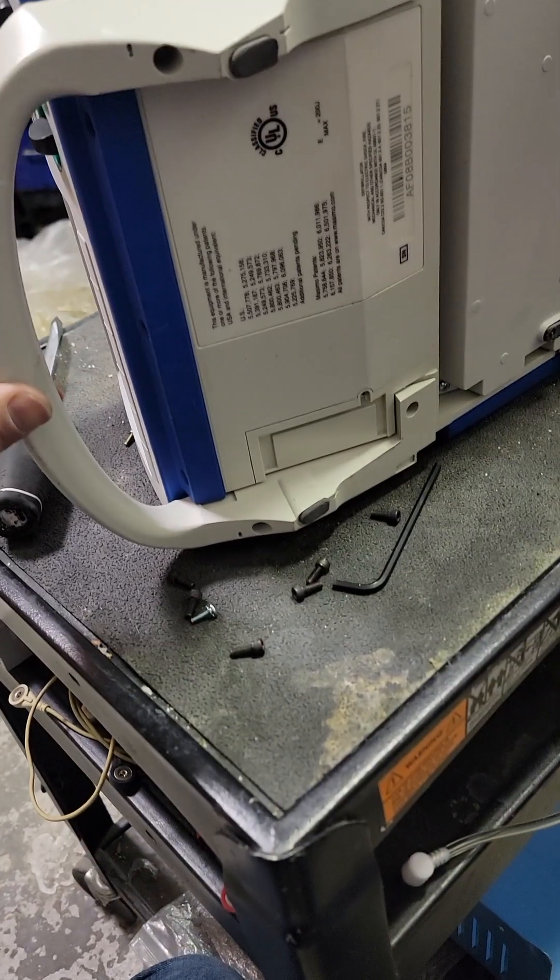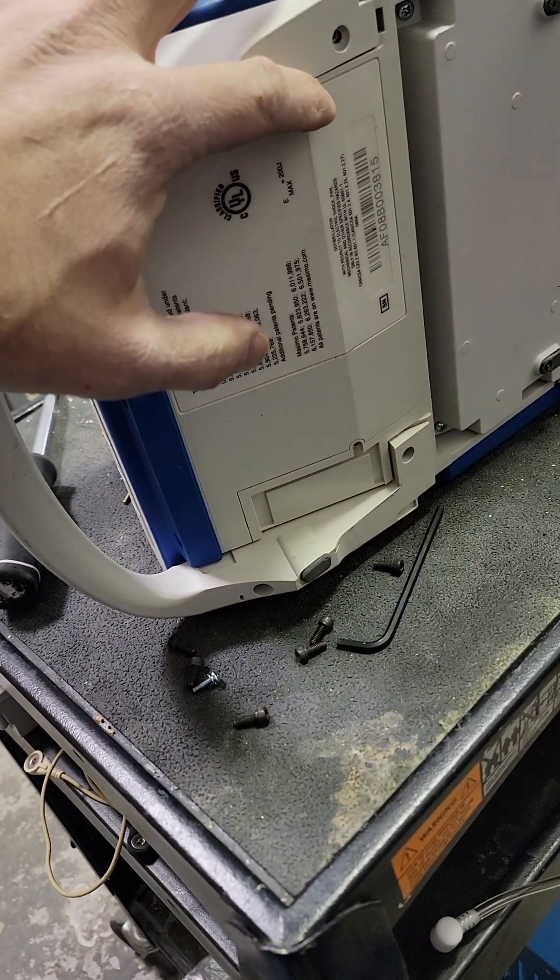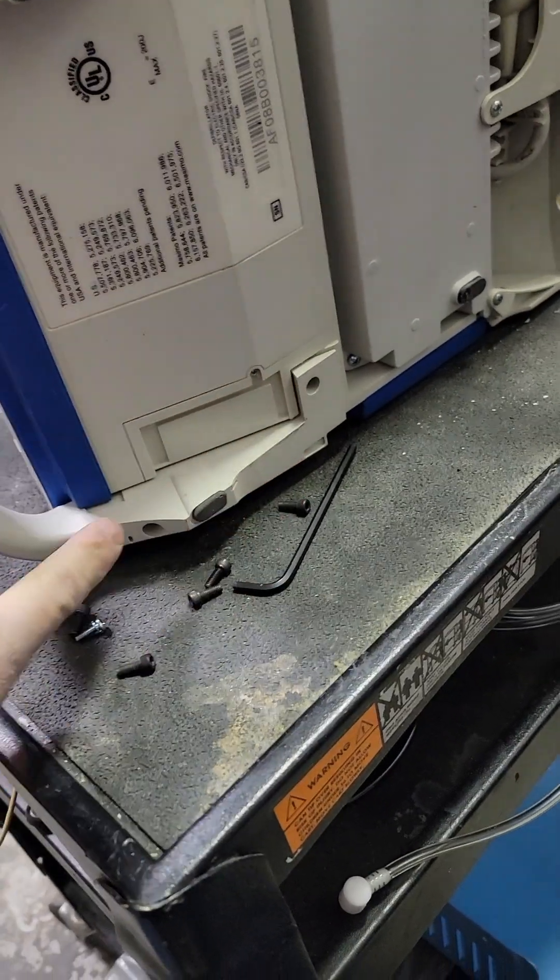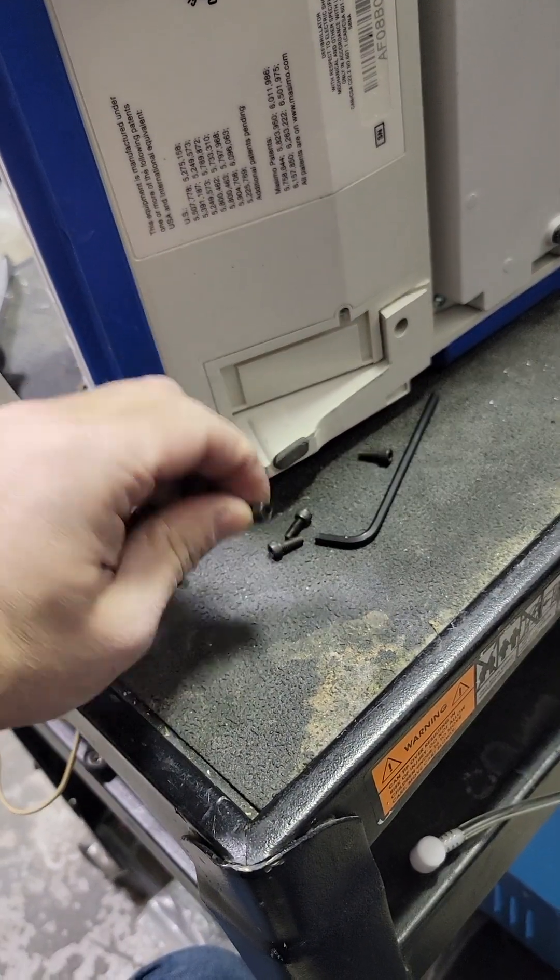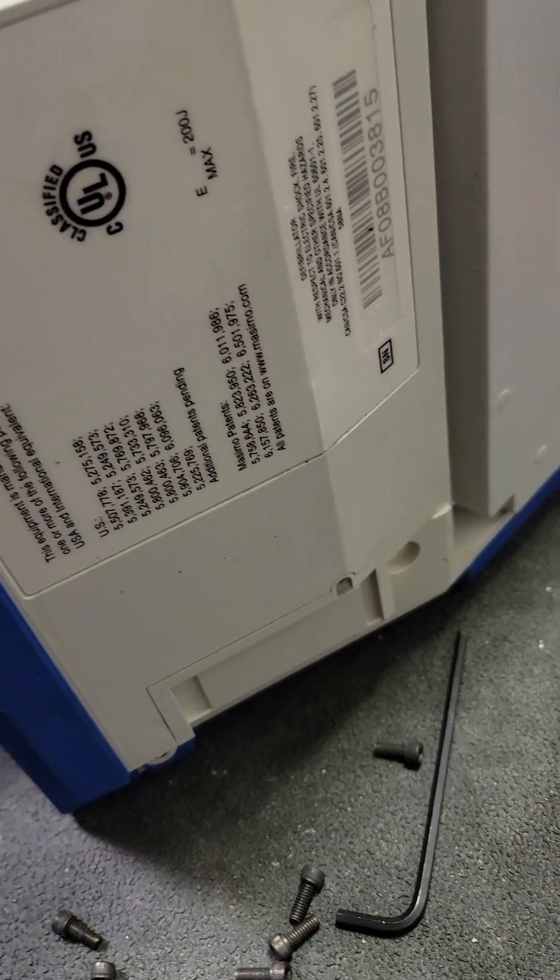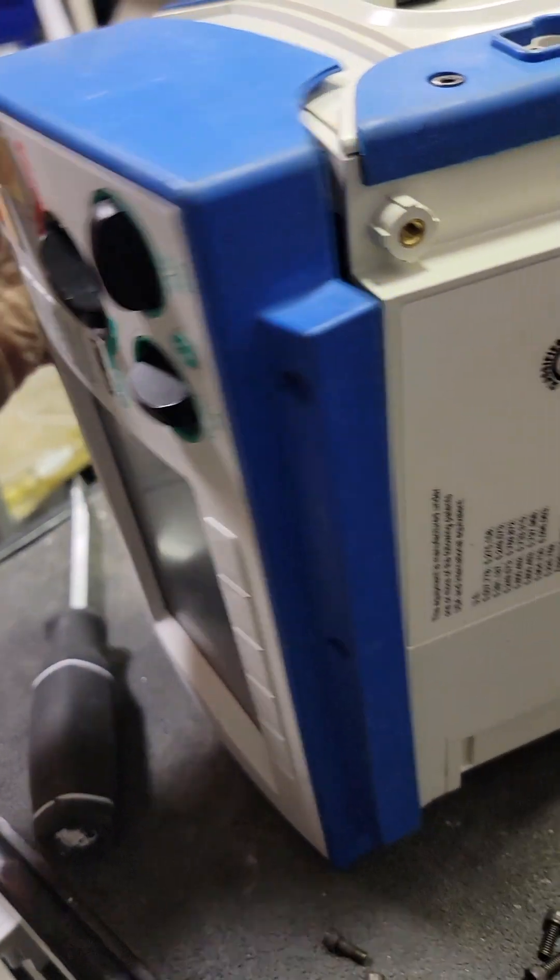That's just four more of those 9/64 screws: one, two, three, four. There you go. And then you should be able to bend this down.